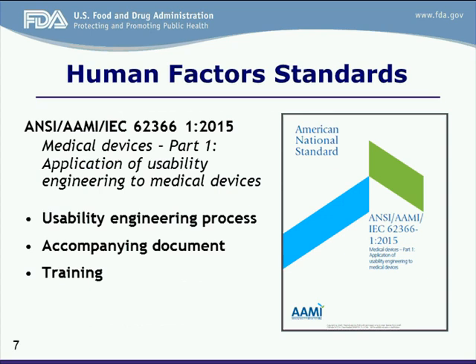Also recently released is ANSI AAMI 62366-1. This is an update to 62366. What this document does is focus more on the safety aspects of usability engineering. Again, as we go through this discussion, the term usability engineering in this document and human factors engineering, which is the term we use in our guidance, are synonymous for the purposes of this discussion.